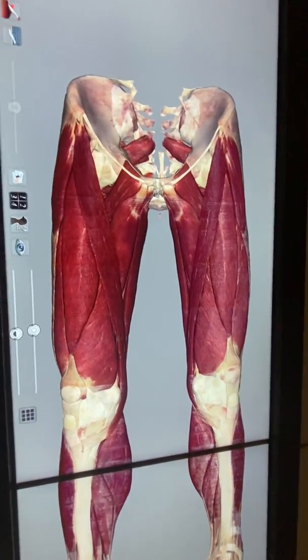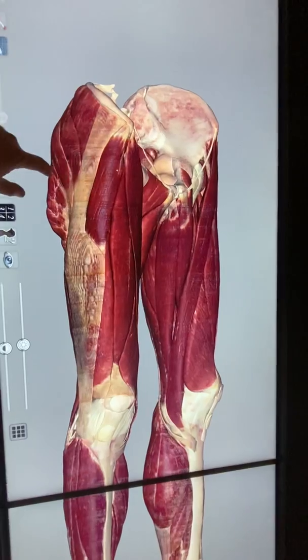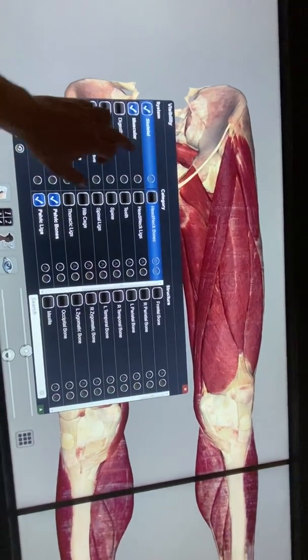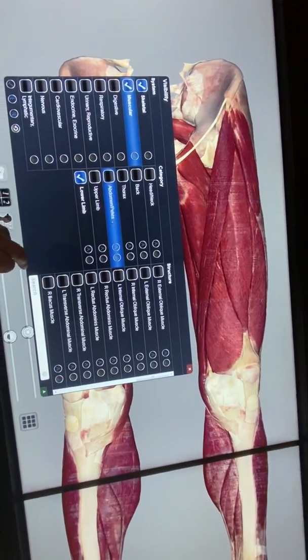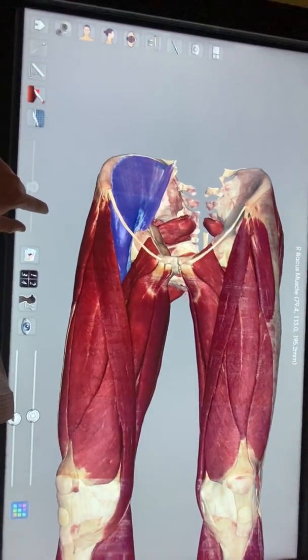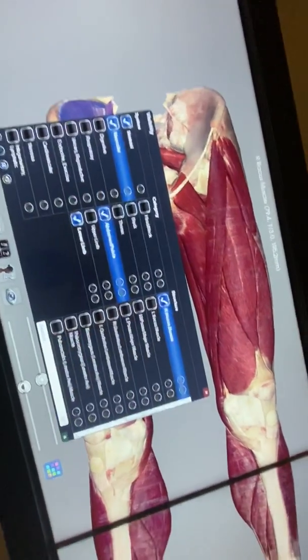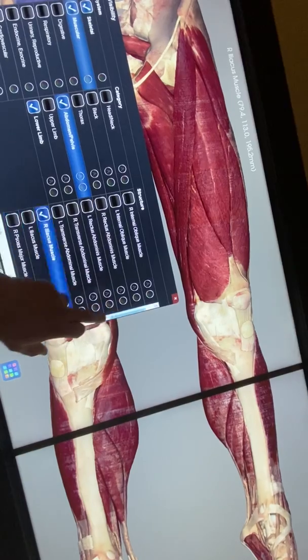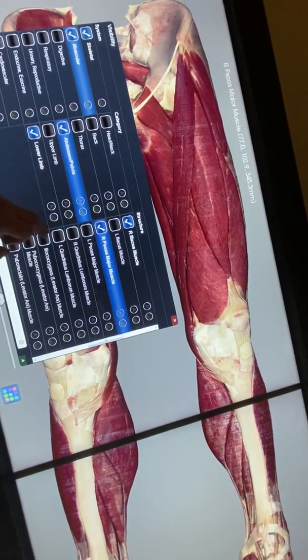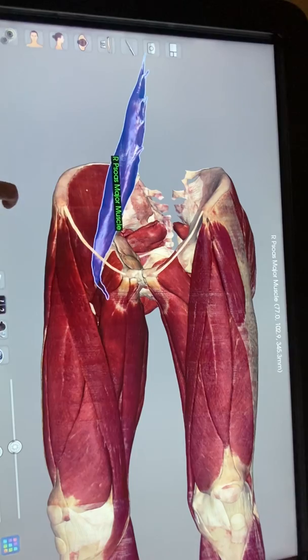This video covers the muscles of the lower limb, using an anatomical table. Starting with the iliacus — it fills the iliac fossa — and psoas major. Together these are the hip flexor muscles.